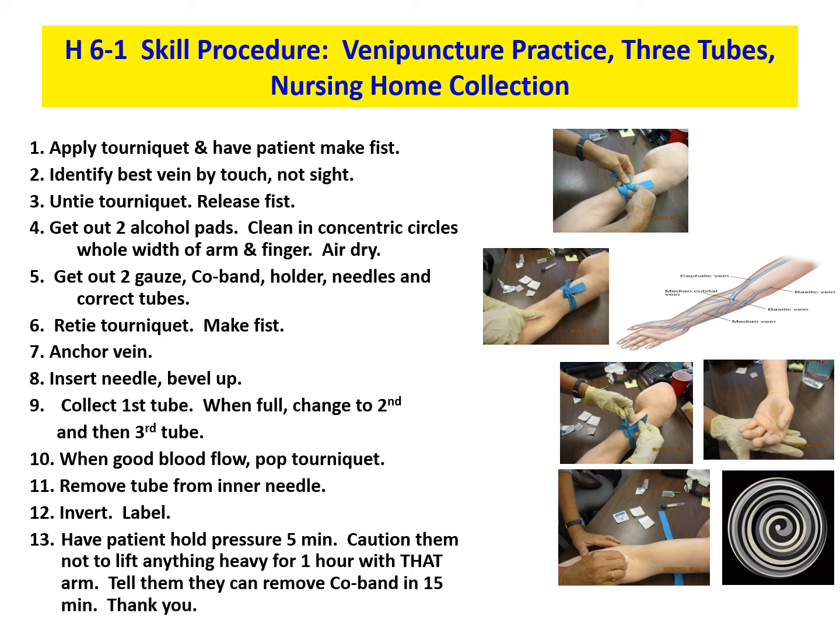And always remember what you say to your patient at each and every step, from getting them to make a fist, to releasing their fist, to making sure that you tell them that they need to leave that on there for about 15 minutes. After that, they can take it off if it stopped bleeding, and not to lift anything heavy with that arm for about an hour, right?